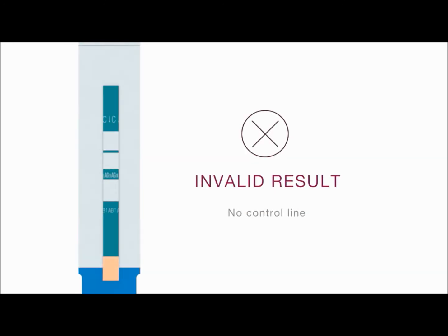Invalid result — no control line: if there is no red control line in the control area of the test unit, even if a red line appears in the lower test area or the upper test area of the test unit, the result is invalid and the test should be repeated. If the problem persists, contact ALEA Technical Support.